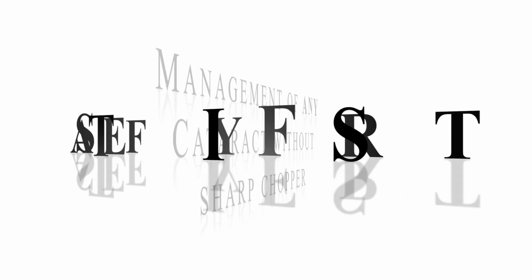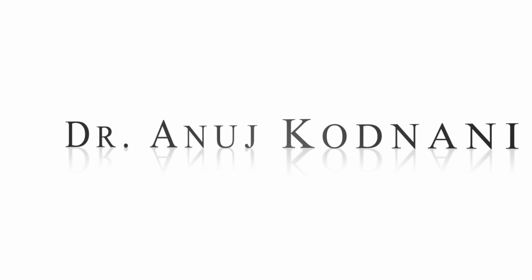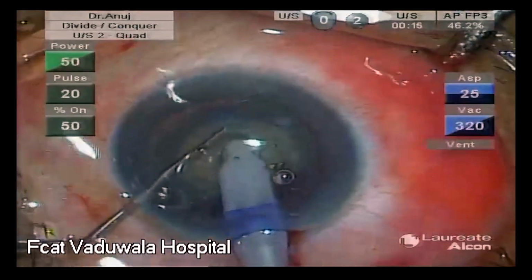Safety first. Management of any cataract without the use of a sharp chopper. To label a cataract being phacoable, it is vital to be able to chop the nucleus into multiple equal-sized fragments. In this chop here, a Sinskey hook is used instead of a sharp chopper.